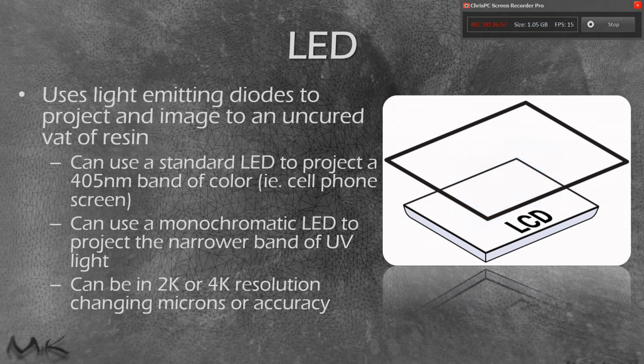These printers used to be kind of expensive and very difficult. When they break, you have to replace the entire LCD screen. But overall, they're becoming a very low price point and a very good way to get into the 3D printing world. The 3D printer I showed on the front screen of my presentation was a small LED printer that you can buy for about $250 online that can utilize a lot of our dental resins for printing things like orthodontic models and surgical guides.